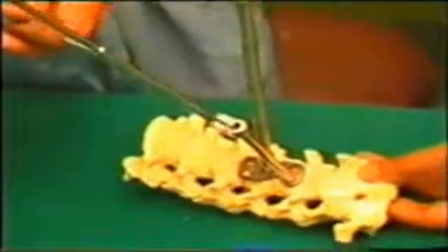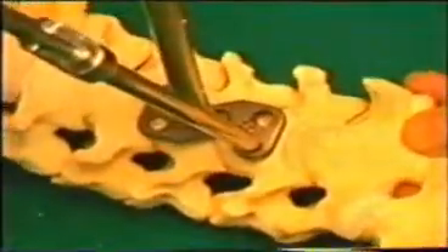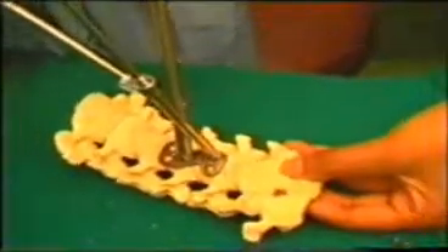The drill goes to a depth of 13 millimeters, because the length of the screw is 13 millimeters. The drill is then taken out and the hole is made into the next slot. You can see the holes — they are angled at a direction of 15 degrees.